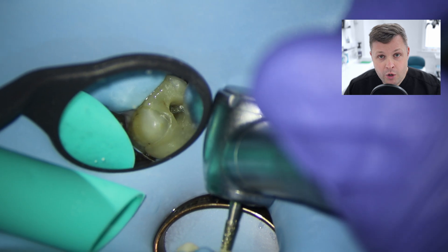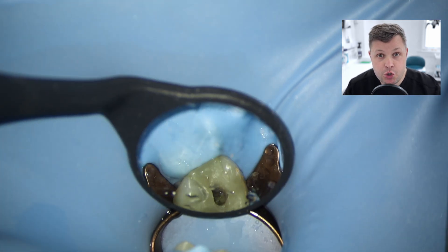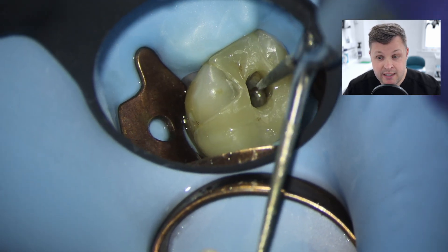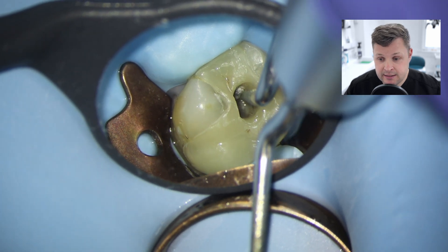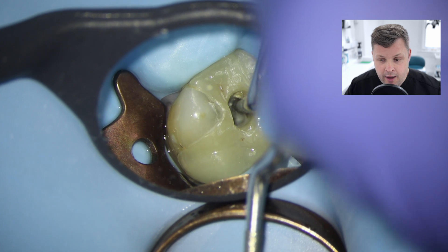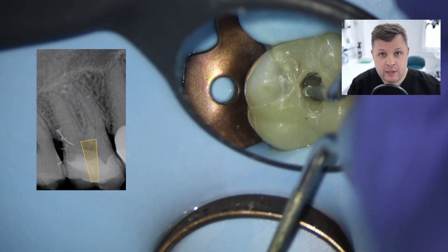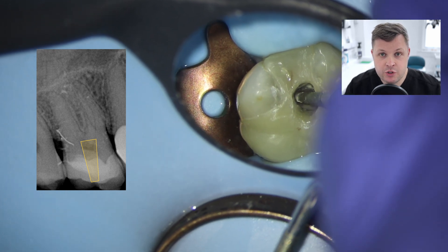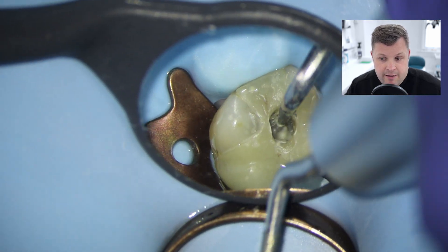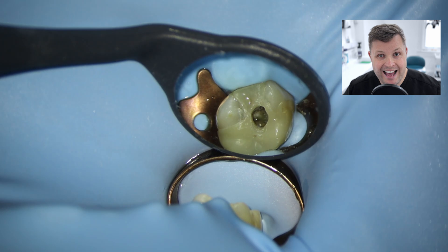Once we have removed the temporary filling, I'm not actually going to adjust the outer outline of the access cavity. What I'm going to do is just remove some of the undermined enamel here, and I'm going to use ultrasonics to open up the access cavity from within. If I draw a diagram here, it's kind of like a trapezoid sort of shape. I'm using the ultrasonics just to get rid of any overhangs and to make sure there is as much straight line access as possible.